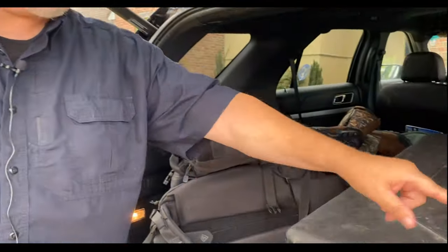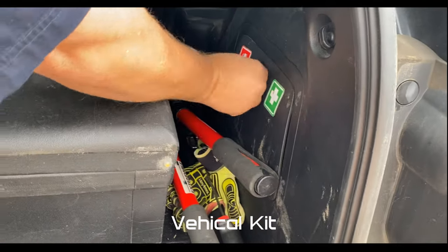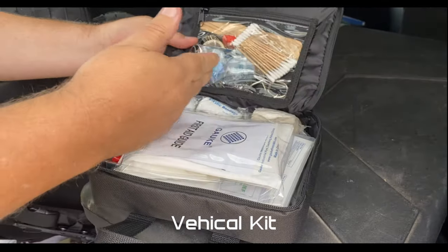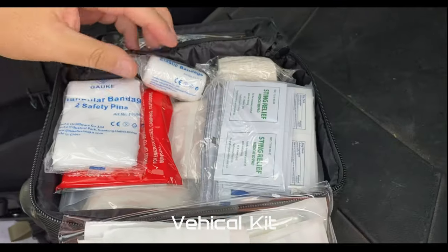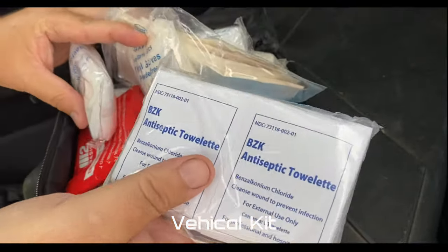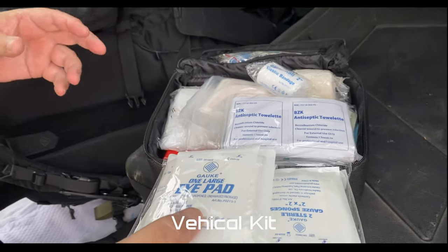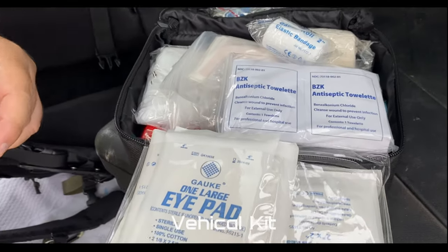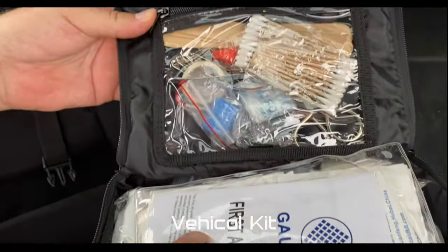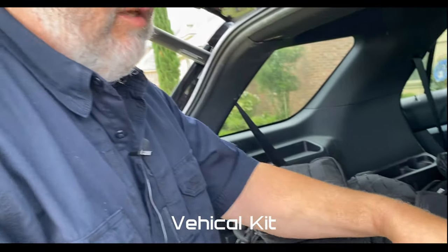So let me direct you over here inside my vehicle. You see the first aid marker. So let me open this up. I carry a first aid kit in the vehicle, and this has got some basic stuff, some gauze, wraps, band-aids, ice packs, antiseptics, got your mask, got your gloves. All right, so basic stuff here. Again, not a really big kit. There are eye pads here, not a different iPad. This is a patch for the eye, not a computer device. So, a small kit, but it may have something that I need to help take care of somebody who's injured that I find on the road.